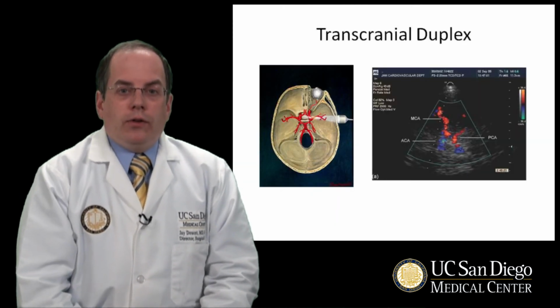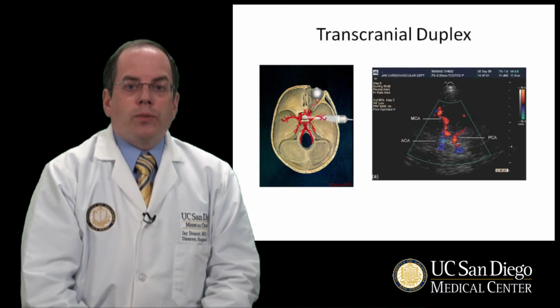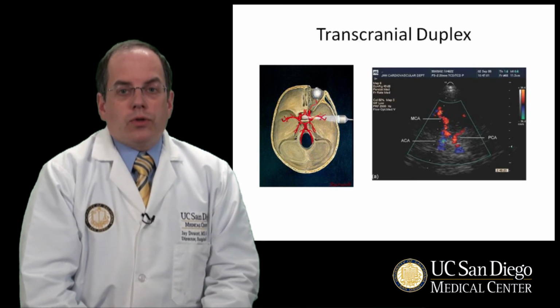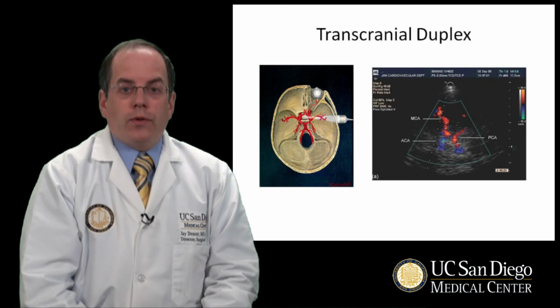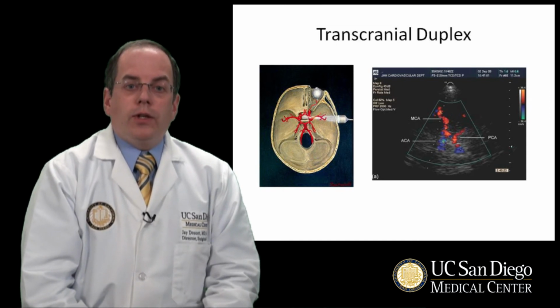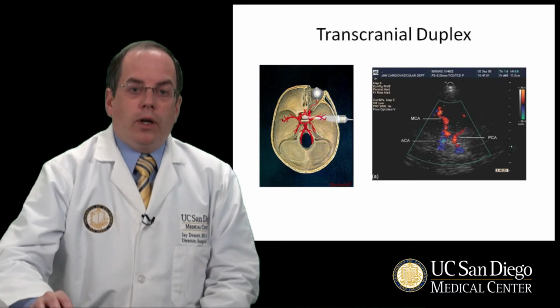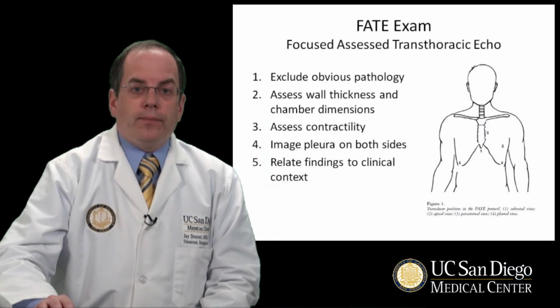This patient is undergoing transcranial duplex, which is a method which Thilo Hochberger has been looking at in the Division of Neurosurgery and Neurosciences as a technique to detect blood flow within the circle of Willis rapidly. This technique may also have some promise in investigations of the shift of the midline, perhaps detecting the early presence of a mass effect due to trauma.